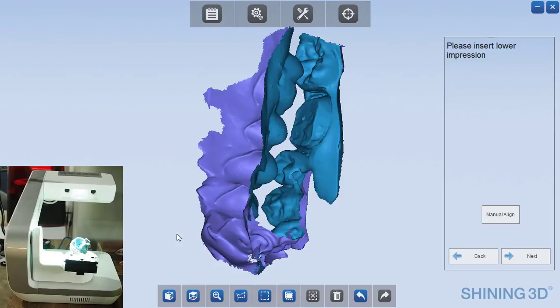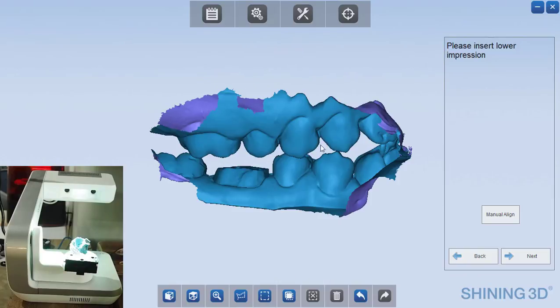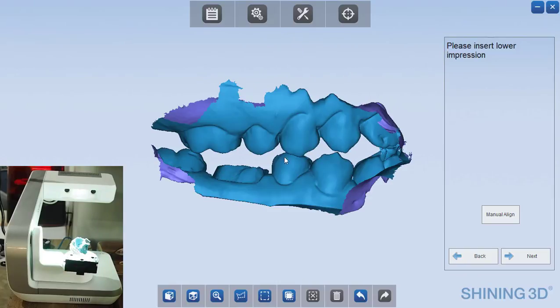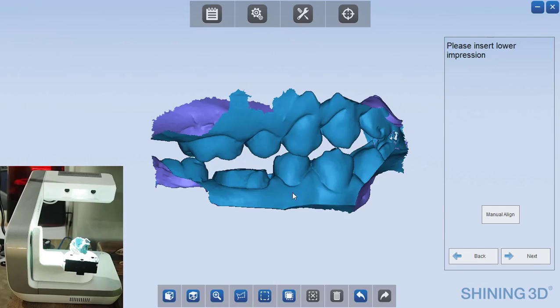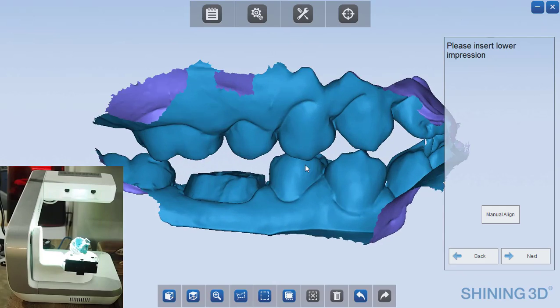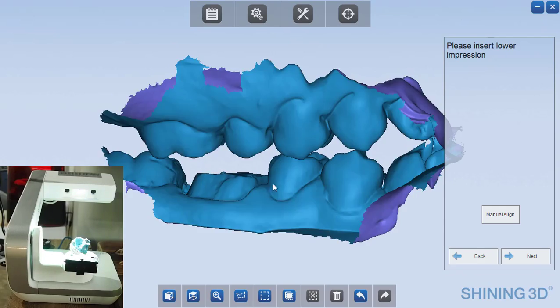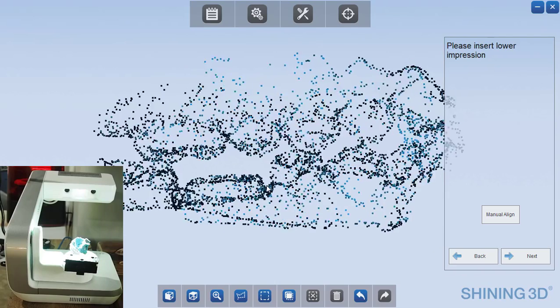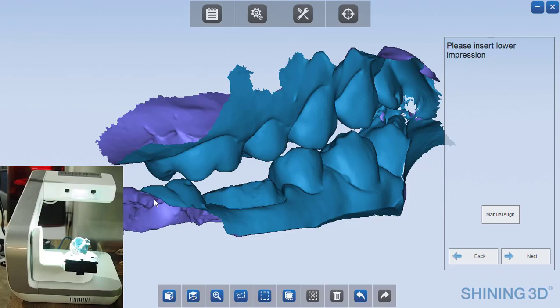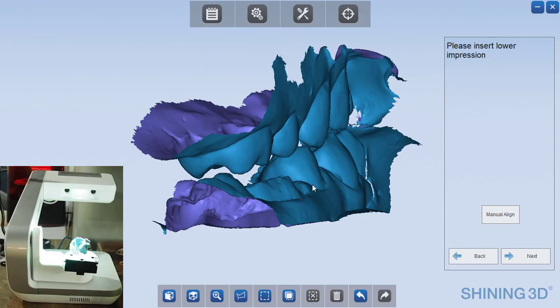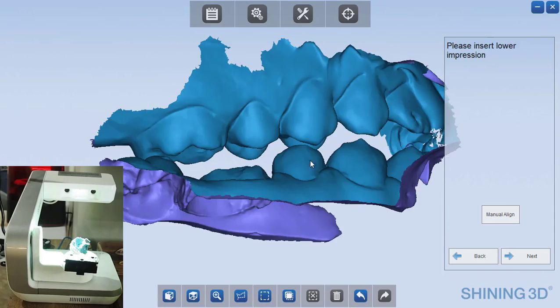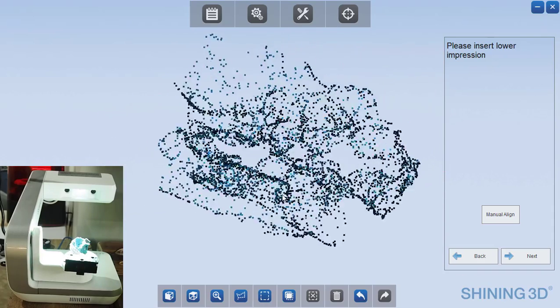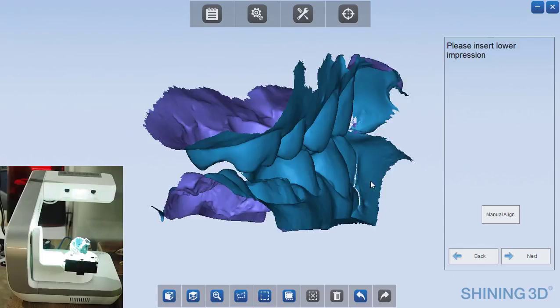And now we have the complete bite. Now it's worth mentioning this looks like these are poorly articulated. This is just an odd impression I happened to grab from my office for demonstration purposes and this patient is in fact not biting down correctly. This is how the impression is. So this does do an excellent job of articulating this patient did like they sometimes do and just went into a funky bite.